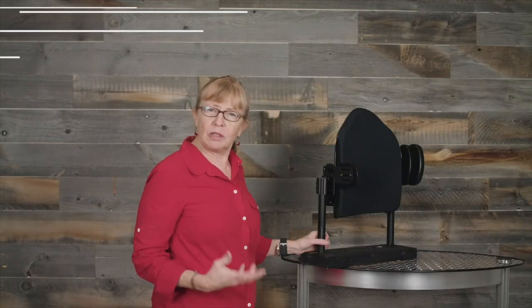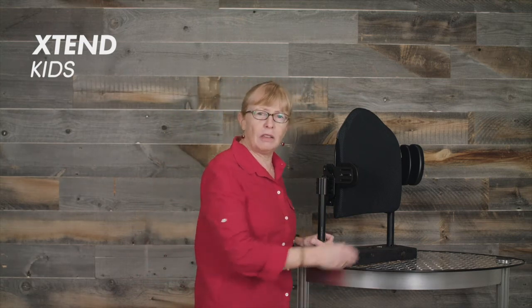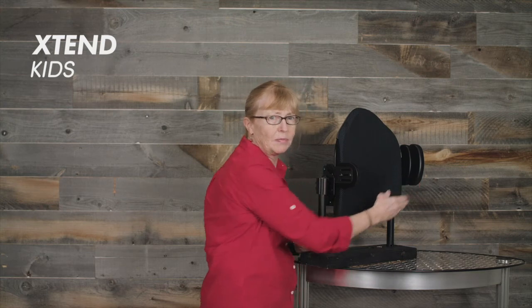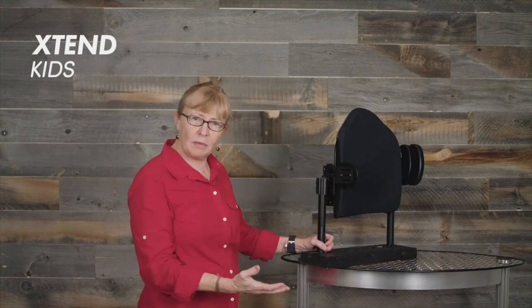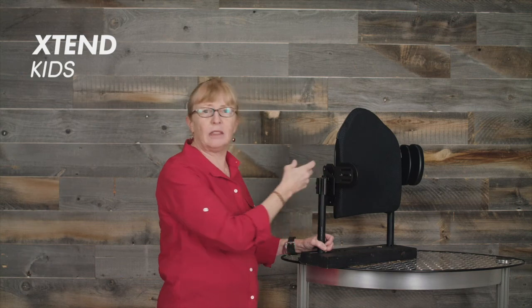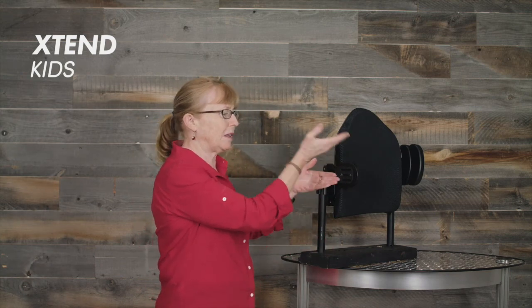The lateral supports for the Xtend Kids: we have a fixed arm with either a single contour pad or a dual contour pad. We also have a fixed arm with a small pad or a large pad, and then there is a swing away lateral with either a small pad or a large pad.